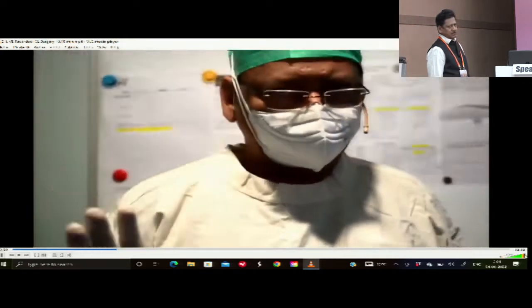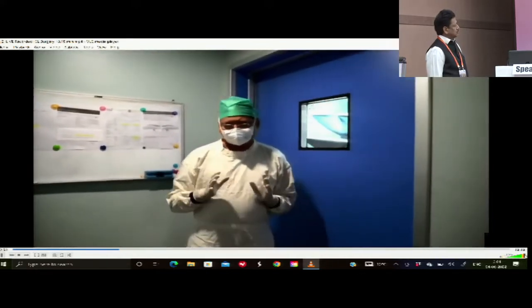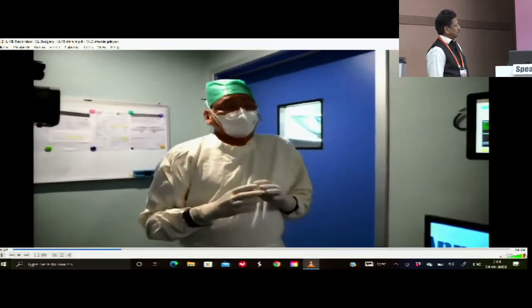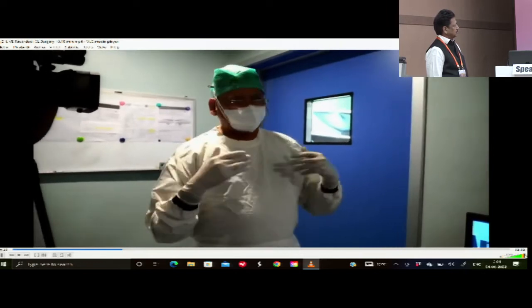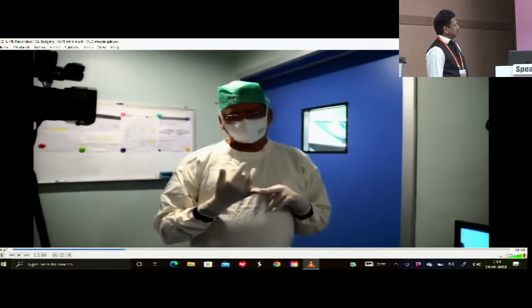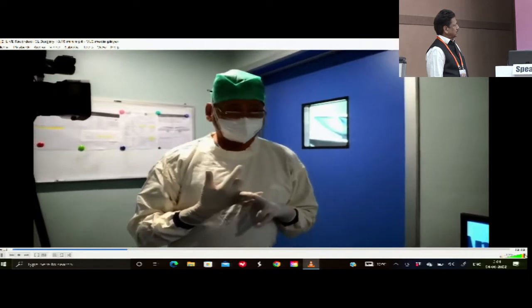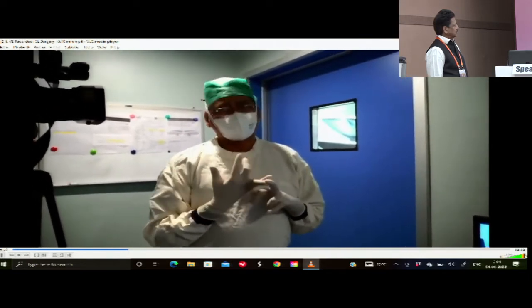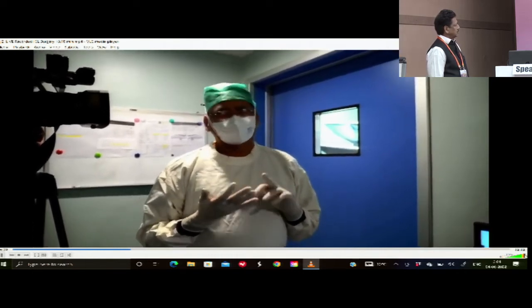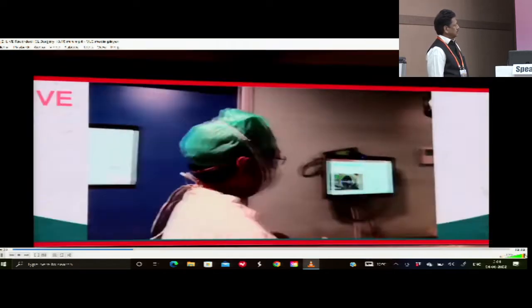Now we come to the patient, but before the patient, let me tell you that there are two ways to mark the axis: the manual axis and the digital axis. As we are doing more and more torics in cataracts, my cataract toric rate is almost 70%. ICL toric rate is almost 95%. Even for half a diopter, I am doing a toric ICL. So more and more, with the torics I do, I am very comfortable with the digital method called the Verion. So here is the Verion.